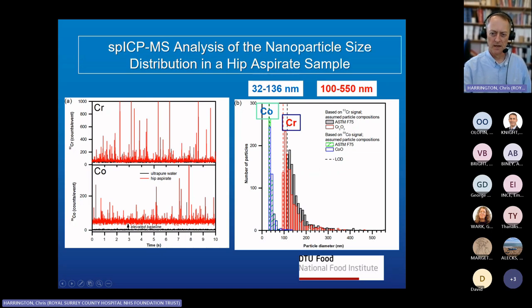And we basically fitted these results to get this distribution of peaks. In this case for cobalt, we're a bit limited on getting the full distribution because of the limit of detection, because obviously the smaller the peak, we need the power of the detection limit to be able to work it out. So we only see half of the distribution here. Anyway, it gave us a first look at doing this sort of thing, but it was quite a difficult thing to do.